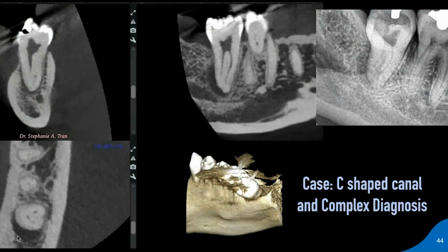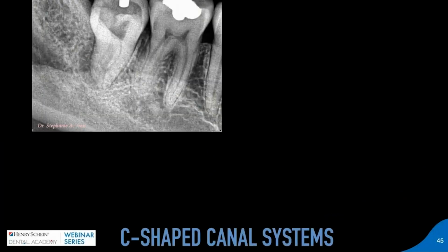It did not appear that the radiolucency extended completely up the side of the tooth, so it was not a clear perio-endo lesion. And this patient was particularly motivated to maintain this tooth. So after putting all the findings together and not being able to confirm any vertical root fractures, cracked tooth, or split tooth issues, we proceeded with treatment.